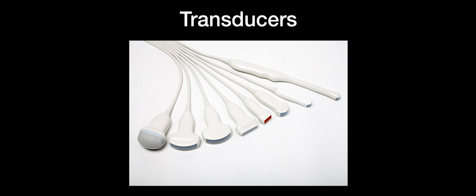You're often faced with a large range of transducers, but for the purposes of what we're doing, we're going to keep it very simple. We're going to look at curved array transducers here.